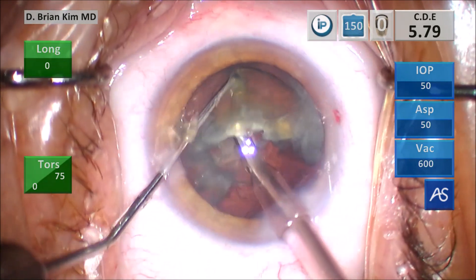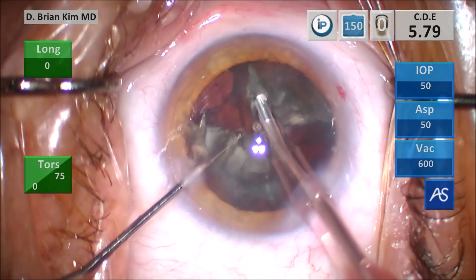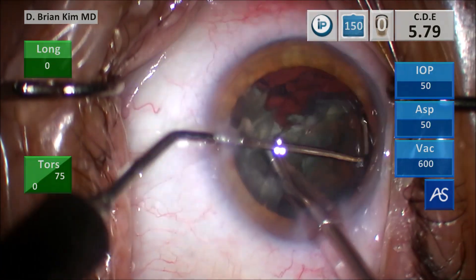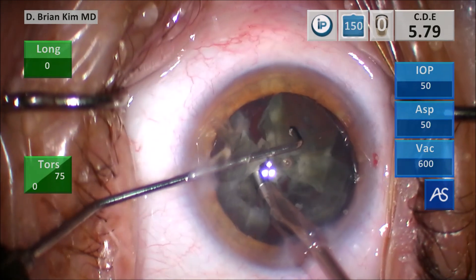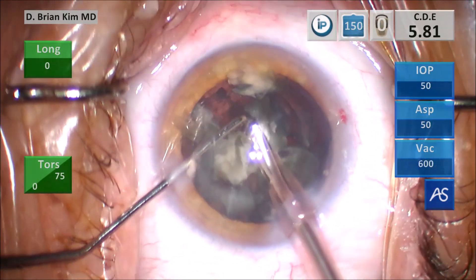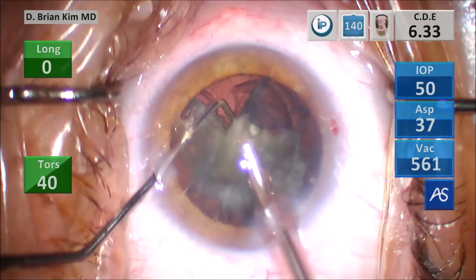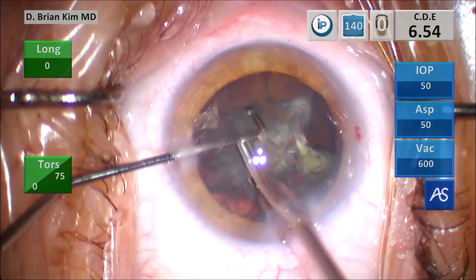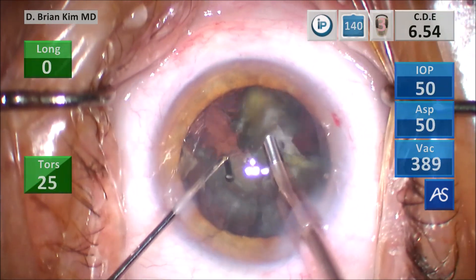If the lens turns, great; if it doesn't, you have to employ a different technique. I turn the second heminucleus in front of me, placing the chopper around the lens, hooking the peripheral lens, and crushing it against the phaco tip — another cross chop. I separate the two quadrants, then place the chopper around the third quadrant, making sure I get around the lens completely. All of this is under irrigation only — no vacuum, no ultrasound. This is a very controlled way to disassemble the lens. With weak zonules you might have a floppy bag; you don't want to accidentally grab the bag with high vacuum. Using mechanical fracturing forces purely under irrigation gives you excellent control.